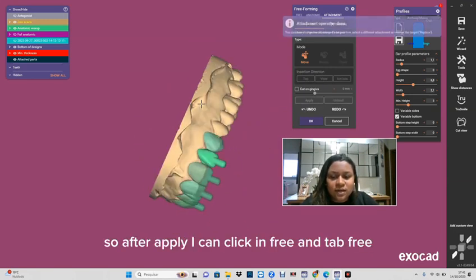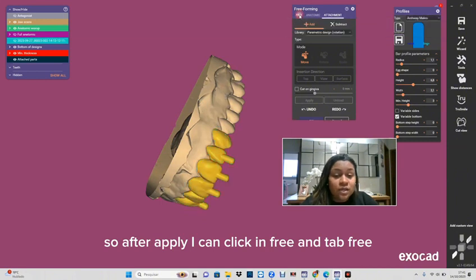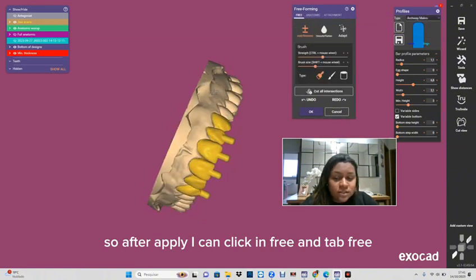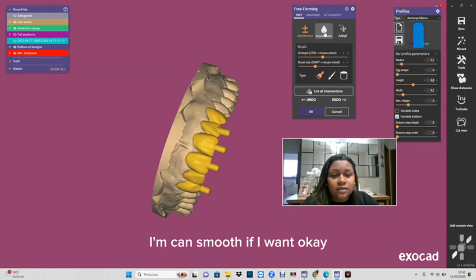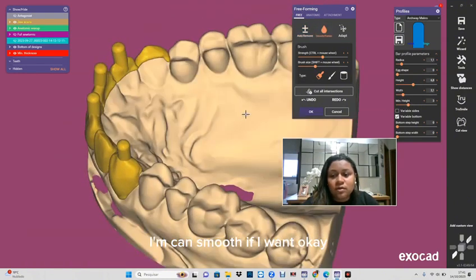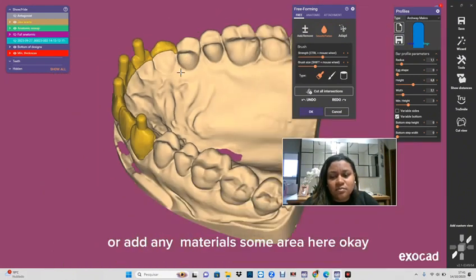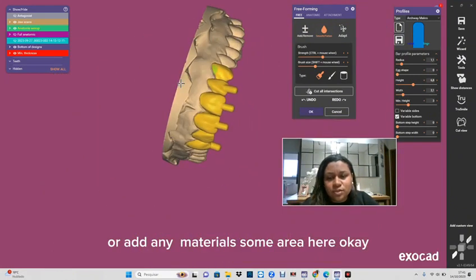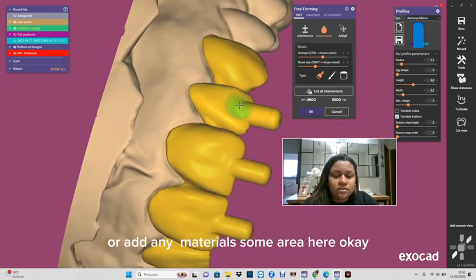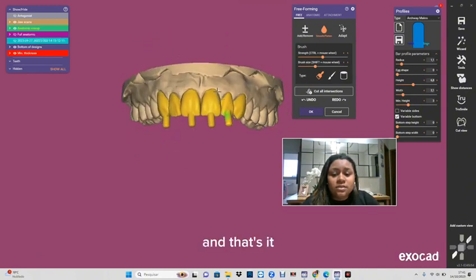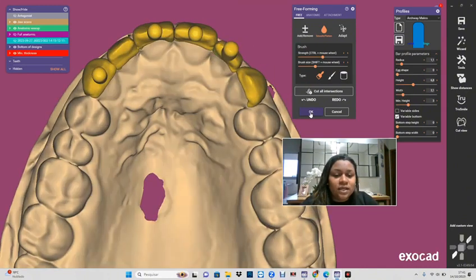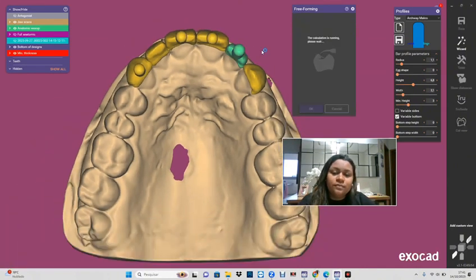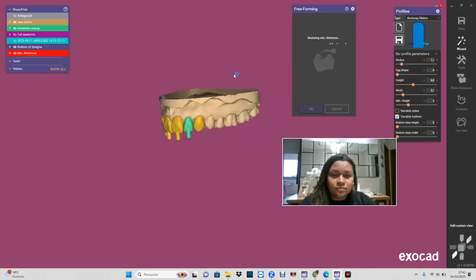So after apply I can click in the free form tab. I can smooth if I want, okay, or add any materials in any area here, okay. And that's it. Click here, okay, and it will save.